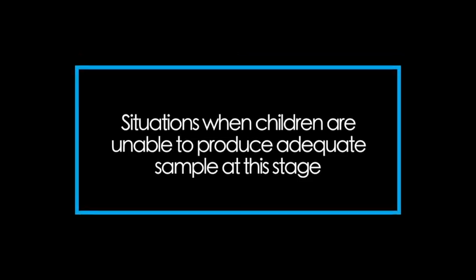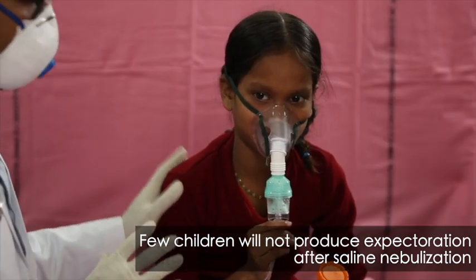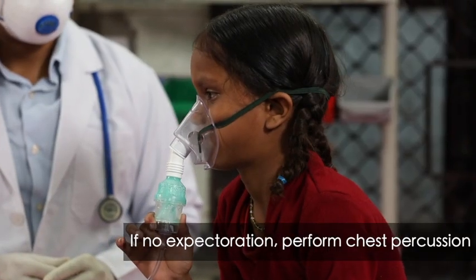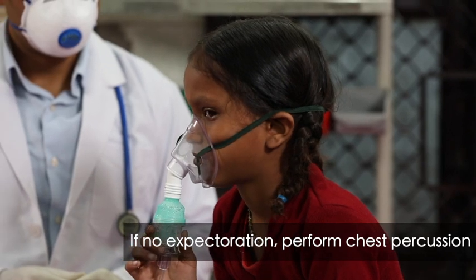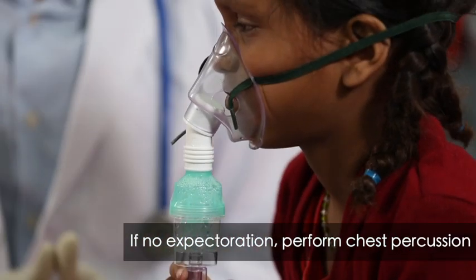Few children will only produce or bring up saliva or no expectoration on their own after 3% hypertonic saline nebulization. In such situations, one can loosen up secretions and assist the child in secreting sputum by chest percussion. The purpose of chest percussion is to bring the secretions from the peripheral to central airways, from where the child can cough out the secretions.